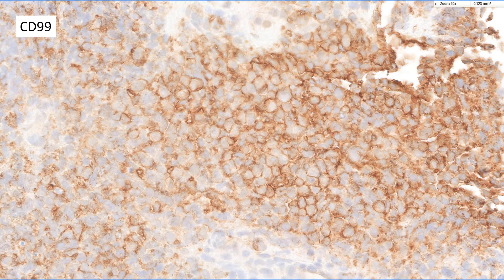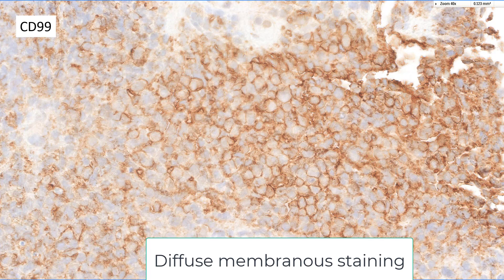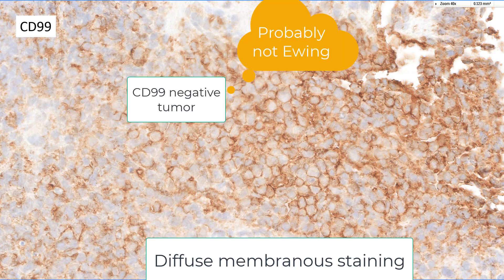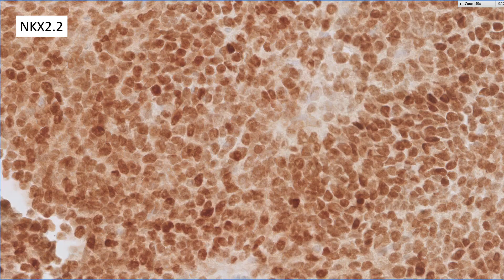If there was only one marker you were allowed to use to diagnose Ewing's, it would be CD99. What you're looking for is diffuse positivity — virtually all cells should be positive — with cytoplasmic membranous reactivity that tends to be fairly strong. Is this 100% specific for Ewing's? Absolutely not; other malignant round cell tumors will stain for CD99. That said, it is pretty sensitive, so if you do not see this kind of reactivity, you're probably not dealing with Ewing's sarcoma.